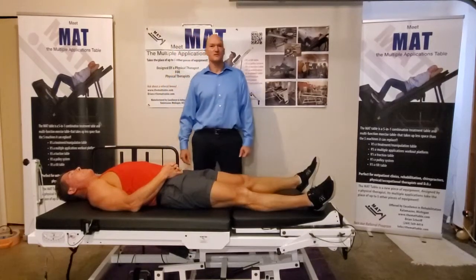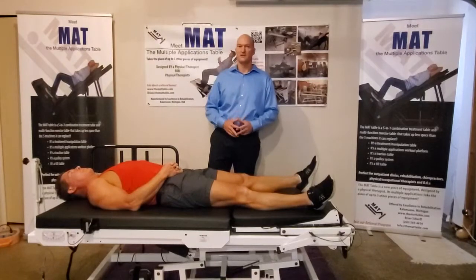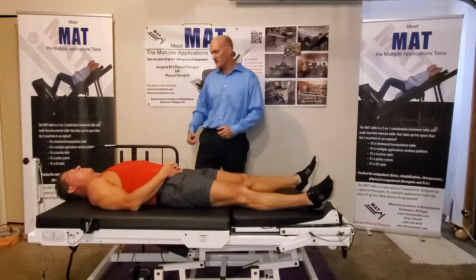This is Brian, physical therapist, developer of the MAT, the Multiple Applications Table. Today I'm going to demonstrate how it converts from a table where you can do exercises to an exercise machine.